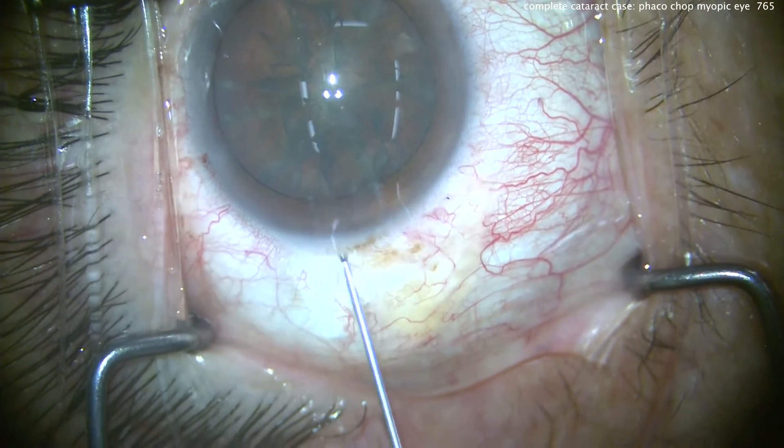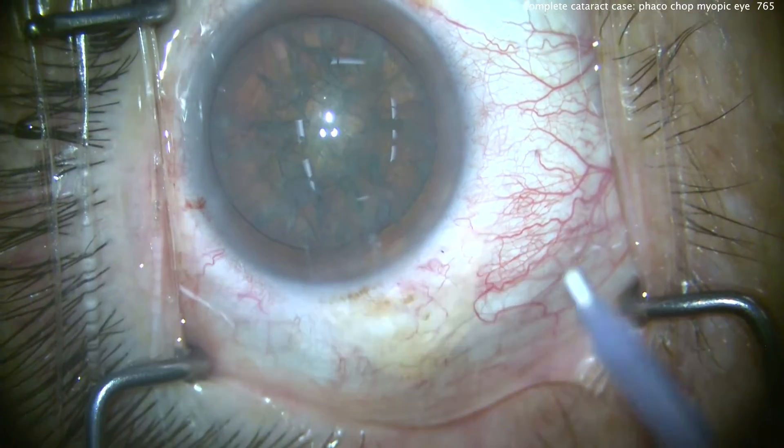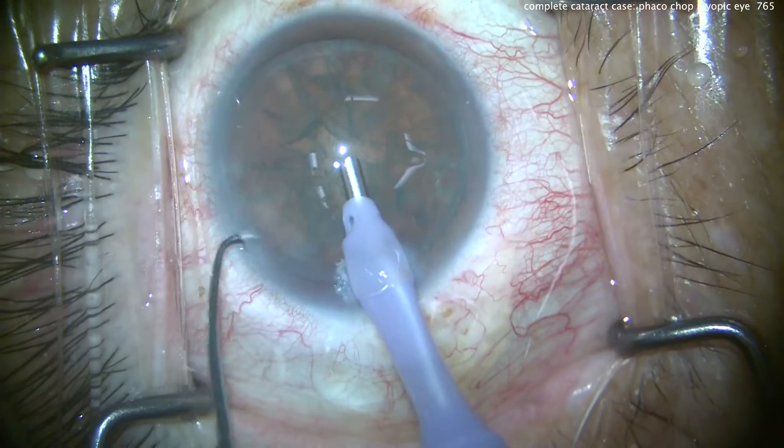Now this patient's not a mega myope. The IOL power is about 9 diopters, and the axial length is somewhere in the 28mm range. So we're going to put our phaco probe in the eye.